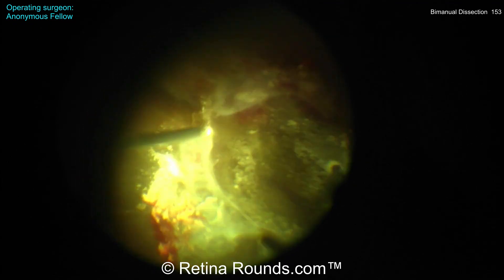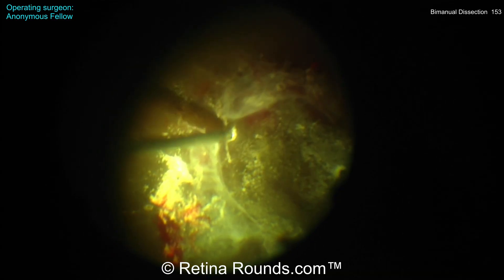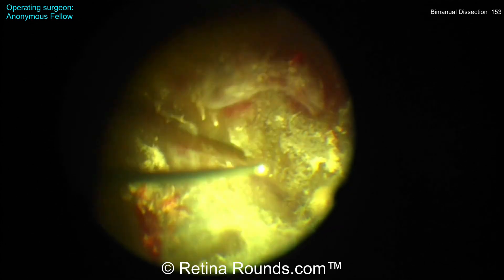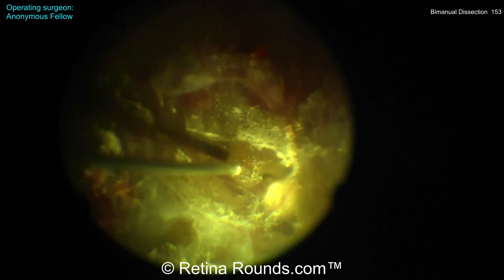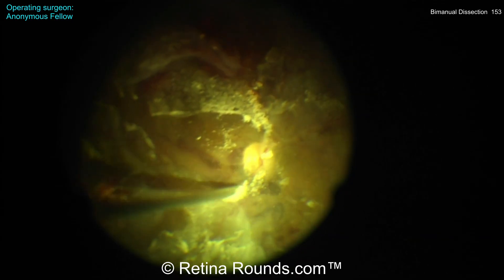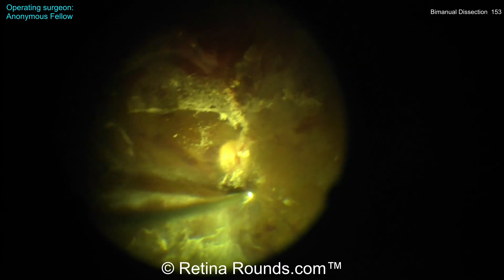The cutter is being used to get underneath that membrane to gently elevate the residual vitreous over the posterior pole, and then to dissect — really just segmenting here — the posterior cortical vitreous along the horizontal meridian. That's going to allow for breaking up this very complex fibrovascular proliferation into smaller, more manageable pieces.